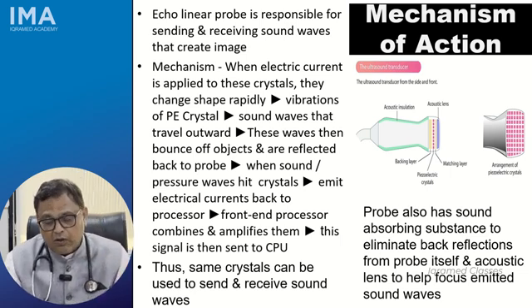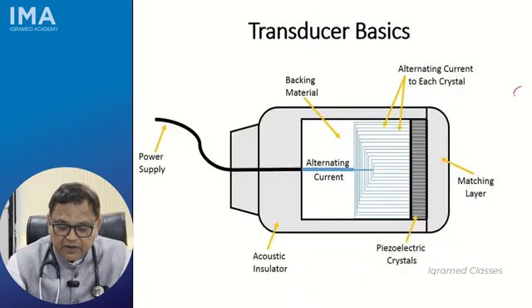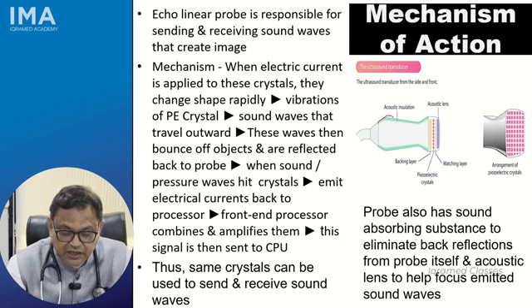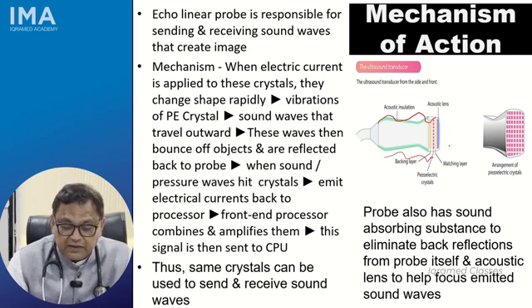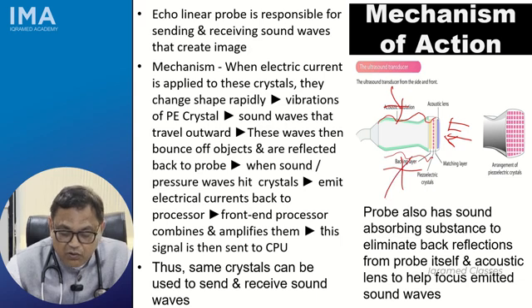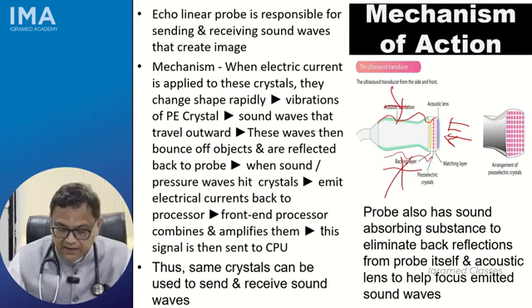Now the important thing is that sound, when it is emitted back, can strike from different parts. But what they have done is apply an insulation here. So this is the insulation which prevents sound from here entering the piezoelectric crystal. So sound from here cannot enter the piezo. Here, on the other hand, there is a lens kind of thing which absorbs the sound and directs it. So sound only strikes the piezoelectric crystal in this direction. It cannot in this direction, it cannot in this direction. Only linearly can it pick up the sound, and therefore there is objectivity in what is happening.